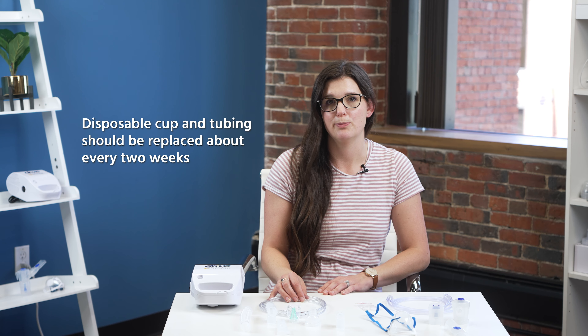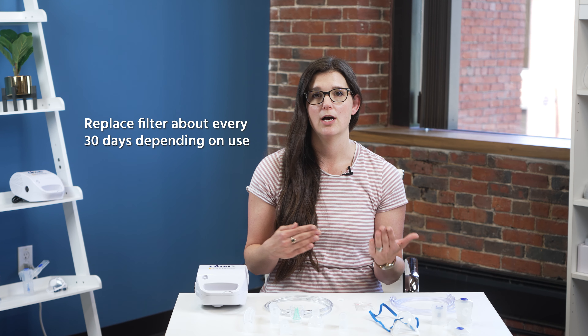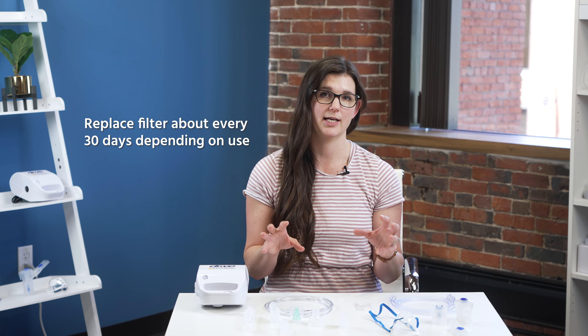The disposable cup and tubing can be used for about two weeks, and then you would throw it away. The compressor has a filter in it, but they give you five extras. The manufacturer recommends replacing the filter around every 30 days, though it really depends on how frequently the compressor and kit are being used. The filter will look gray when you need to replace it.